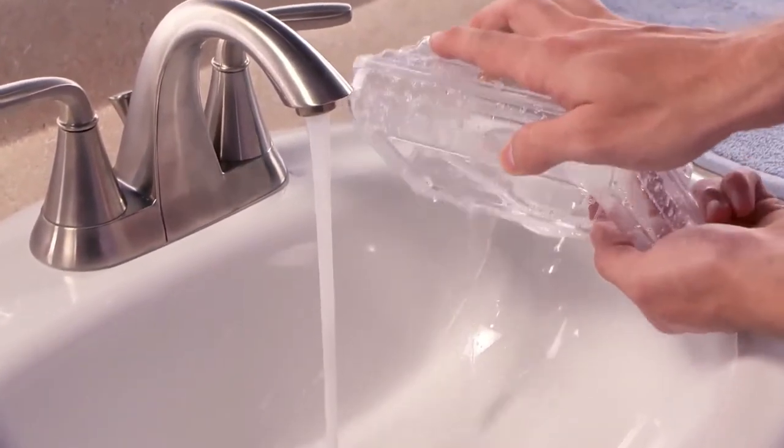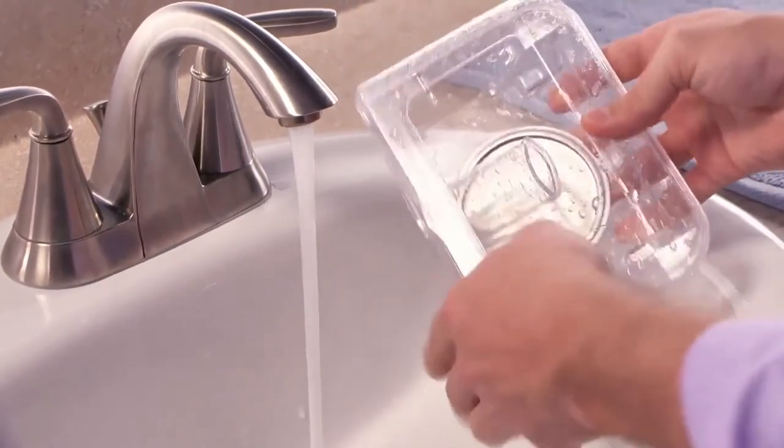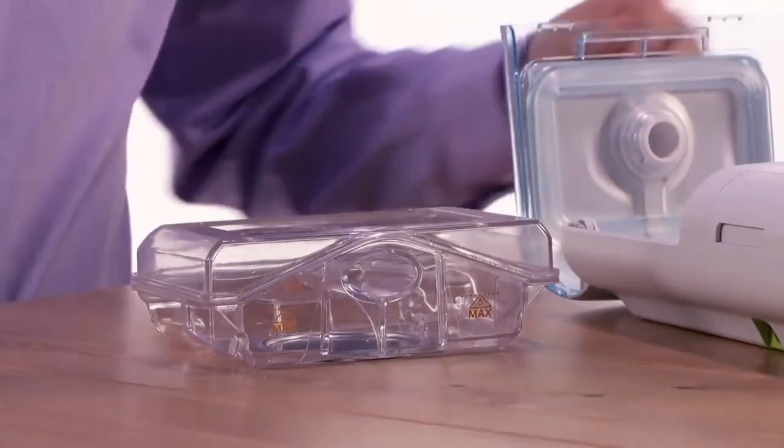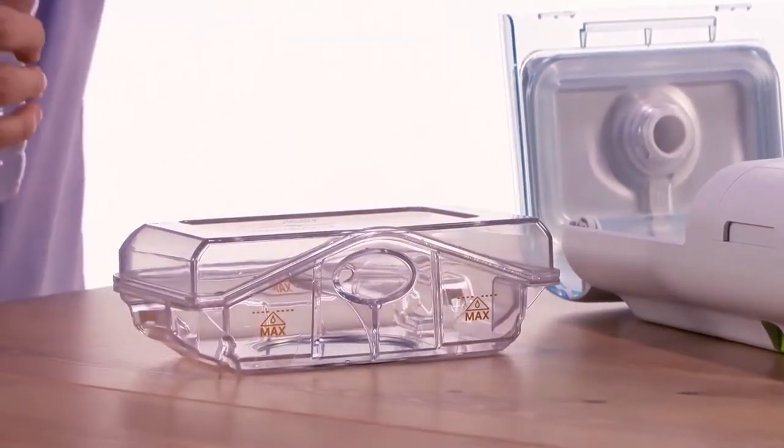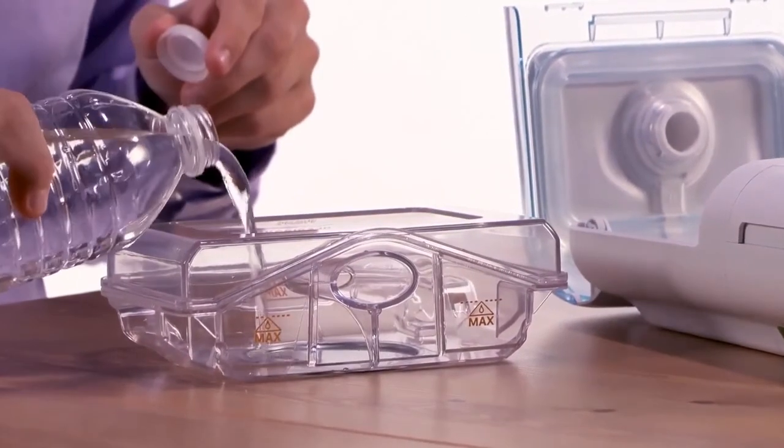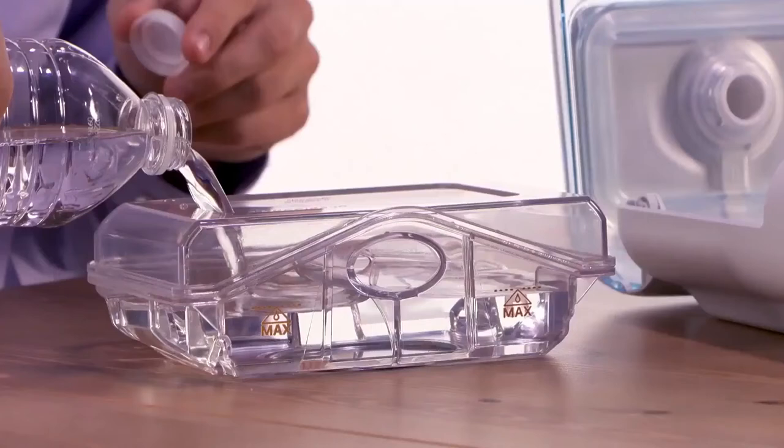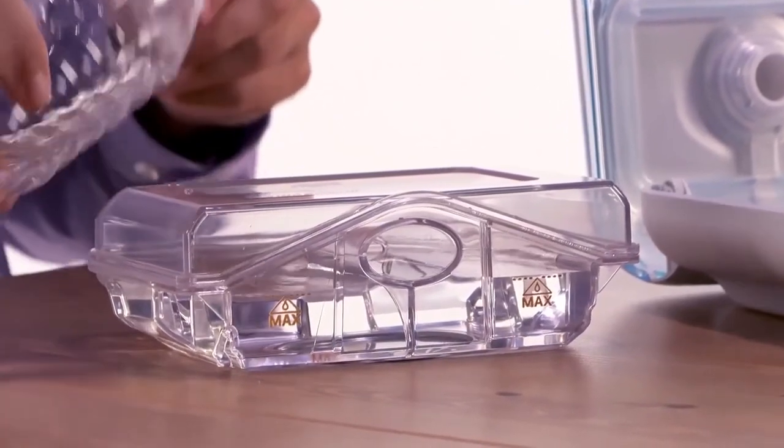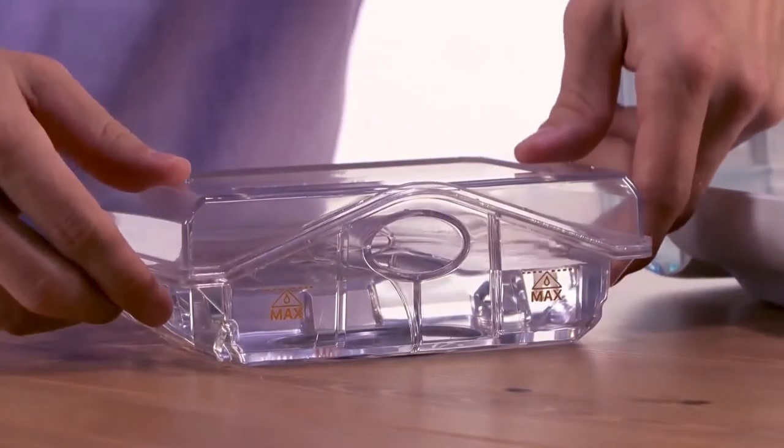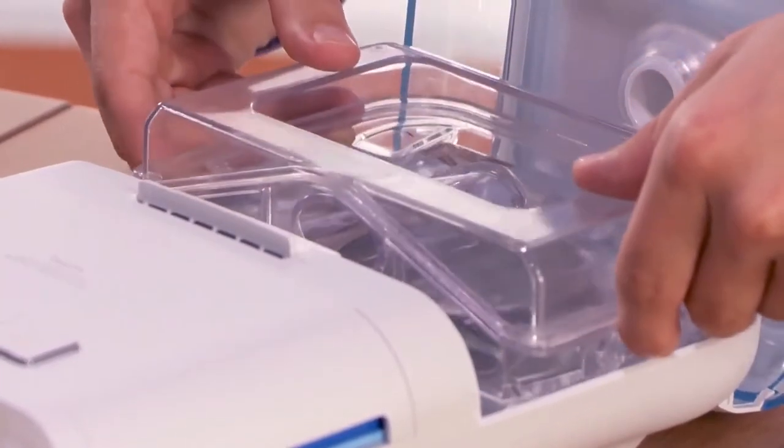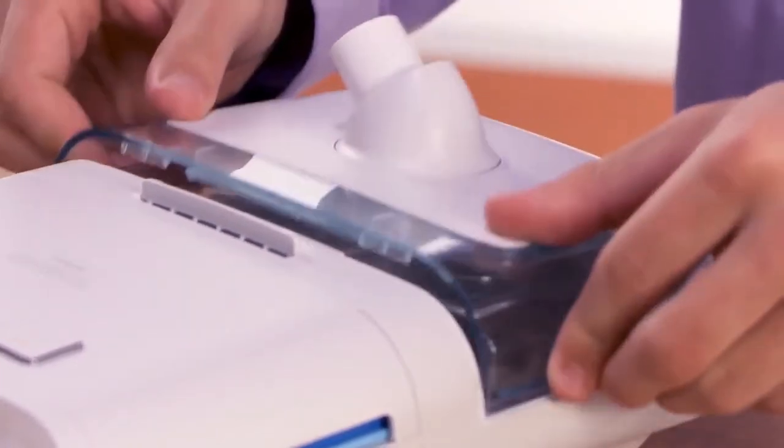To reduce damage to your device, always remove the tank before filling. Set the tank on a firm, flat surface. Fill the tank with distilled water no higher than the maximum fill line. Carefully place the water tank into the humidifier and close the humidifier lid until it snaps shut.